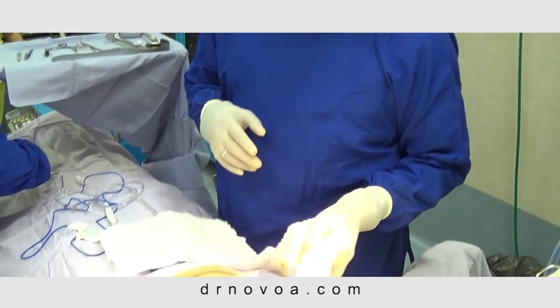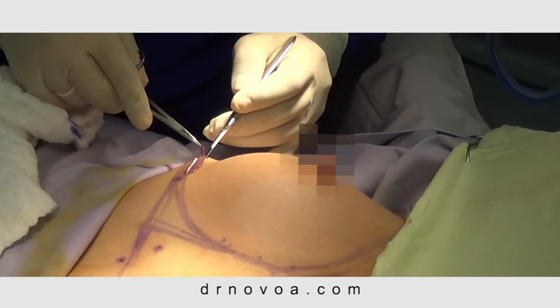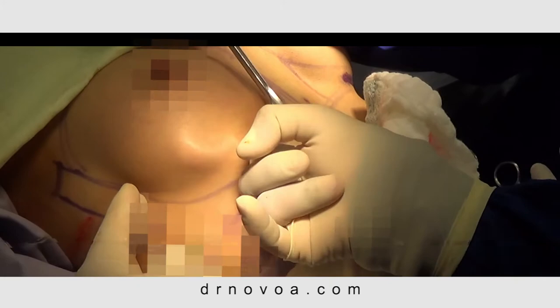Surgery begins with infiltration of area 1, which is the mid-sternal line, followed by infiltration of areas 2 through 5 to include the previous scar. The scar itself is then removed. Sharp dissection continues to the implant pocket. Adhesions formed by the textured implants are blunt dissected and the implants are removed.